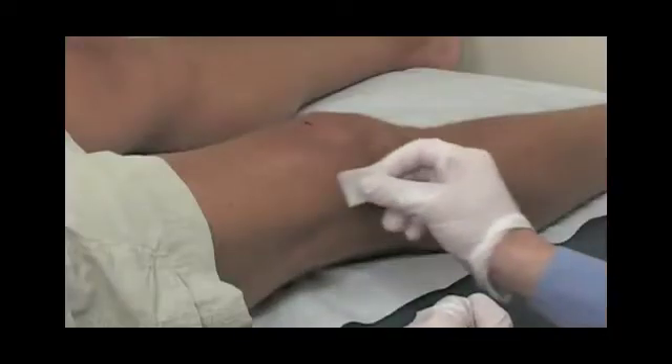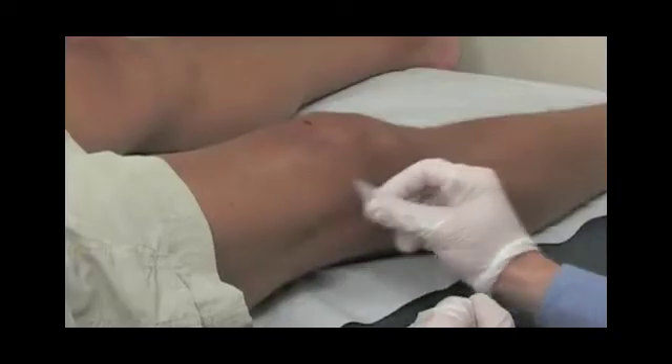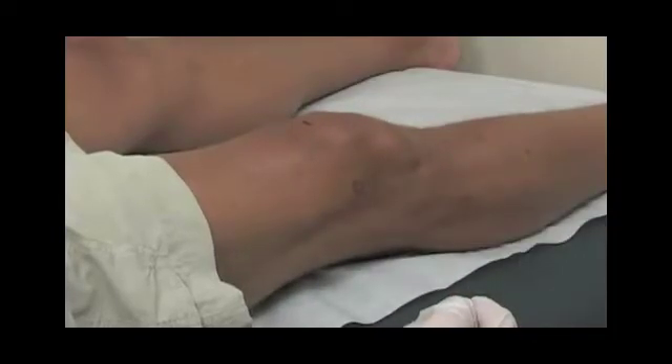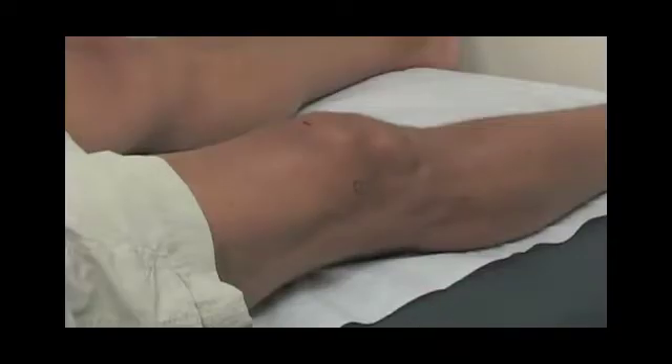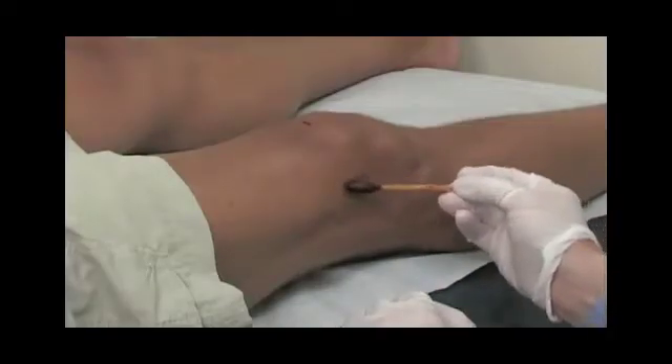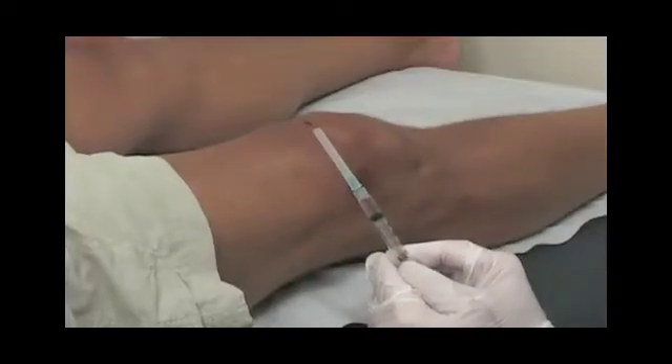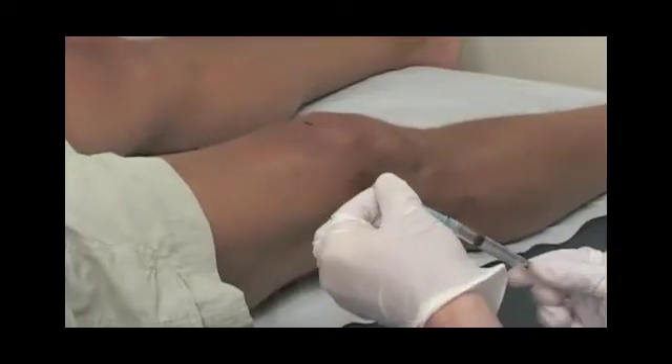Once the area is marked off, I'll place an alcohol pad on the surface, followed by a betadine application. We'll let the betadine dry. This is all to increase our chances of a nice clean technique and avoid any chance of infection, which is very rare with these injections.